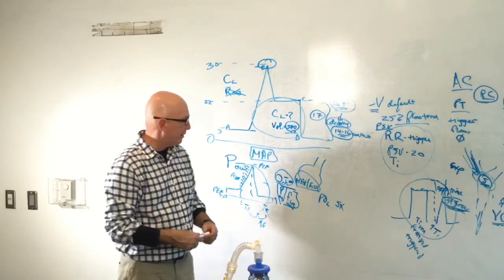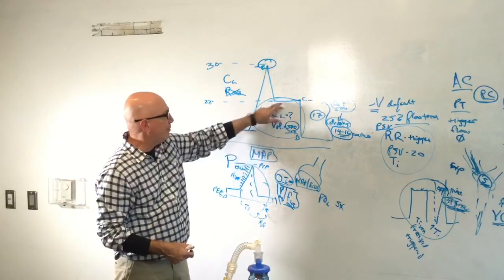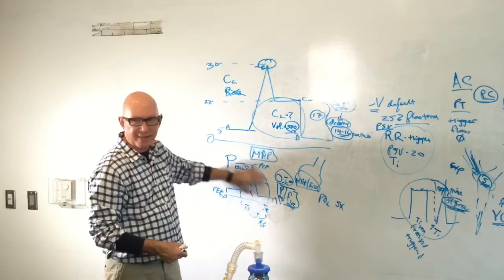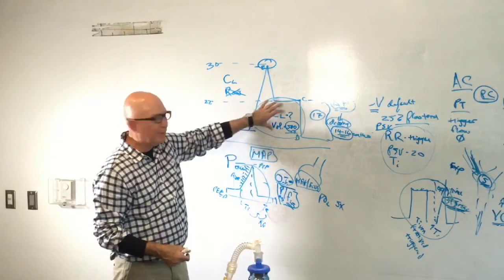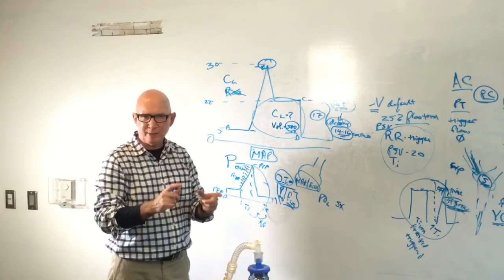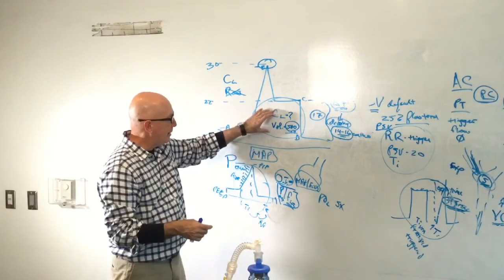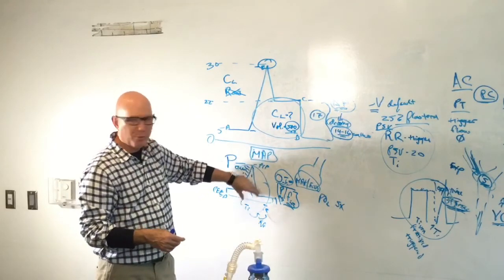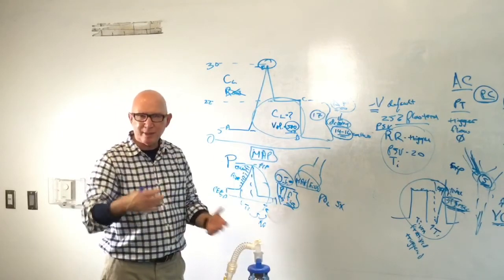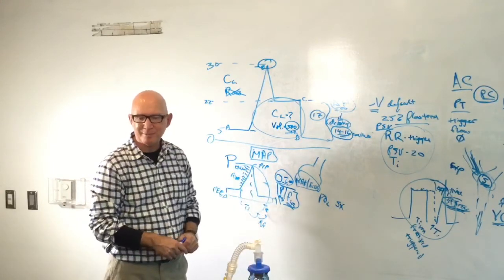I hope that answers your question, Dennis, because you were asking about mean airway pressure and plateau. Mean airway pressure is a function of dynamic factors, whereas the plateau pressure is a static number. So the two of them don't really relate to each other. You can't look at one and say... I'll have to give some more thought to this. I was about to say you can't look at one and say the other one's going to be bad or good. Actually, you probably can. So I'll take that back.